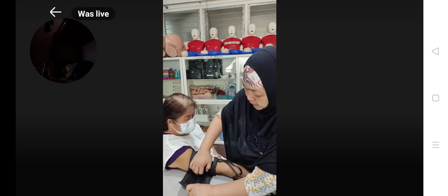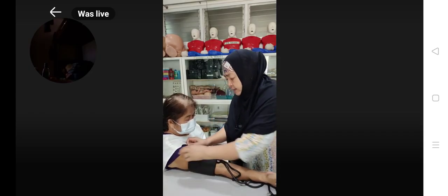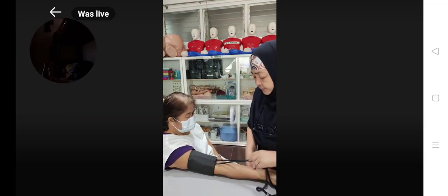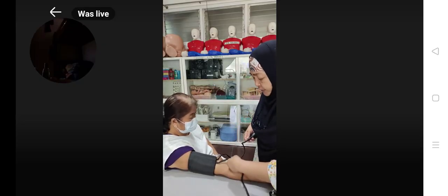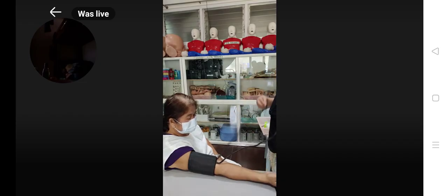Why should it not be too tight or too loose? So that it will not give you a false reading on your blood pressure. So you're going to fix it.